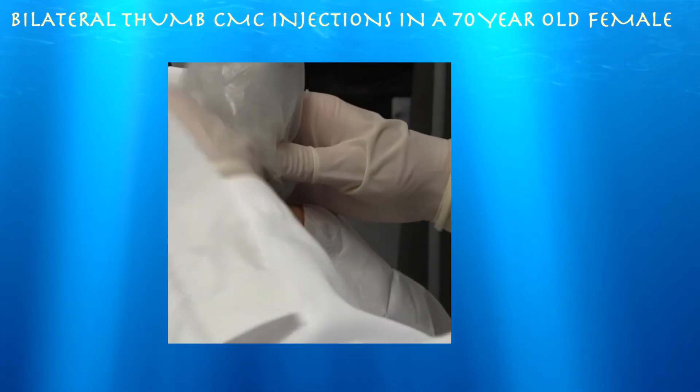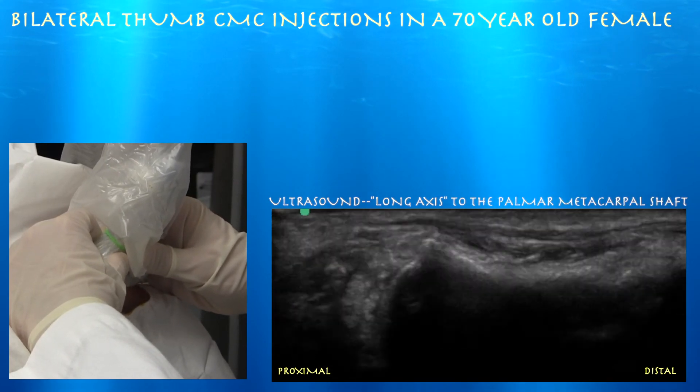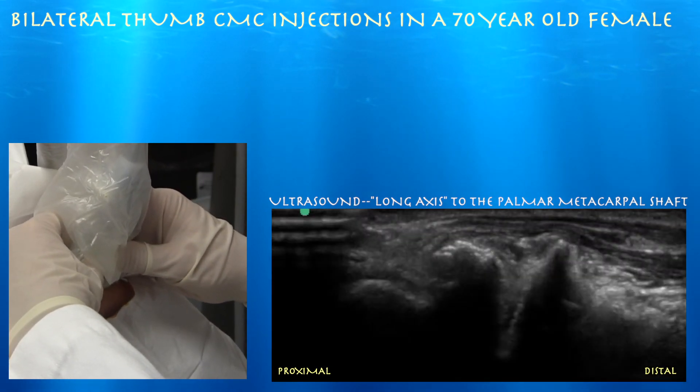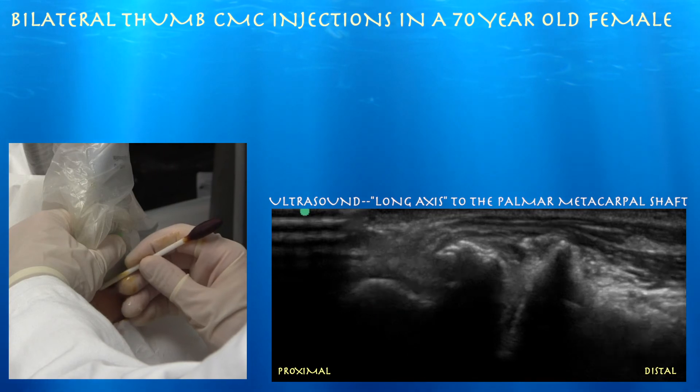So we're doing her right side now. Right side of the screen is distal. You can see her first metacarpal and there's her CMC, which can also be arthritic as well. Here's a nice view where you can see the first metacarpal base, trapezium, and scaphoid all right next to each other in one view.